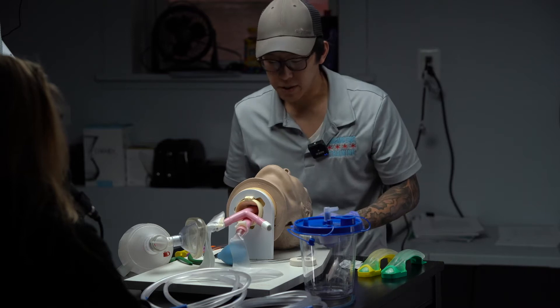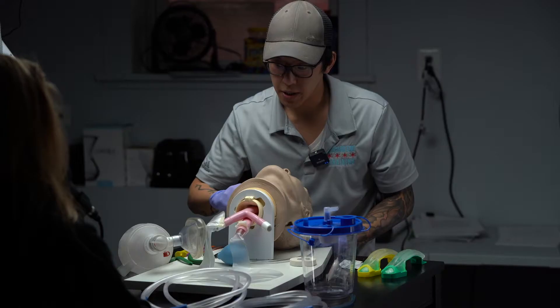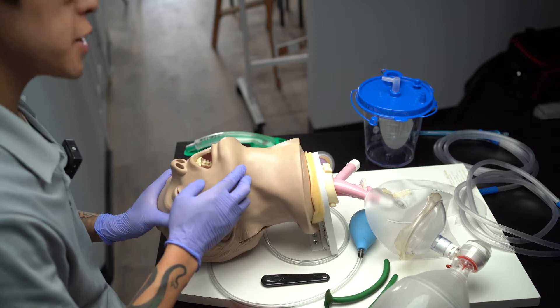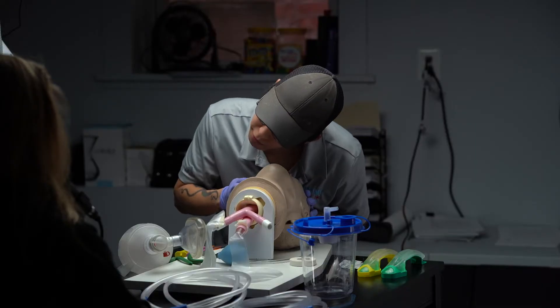I'm going to call for ALS at this time. I'm going to check for a pulse no longer than 10 seconds. You feel a weak pulse. No CPR is needed. I'm going to provide a head tilt, chin lift, and I'm going to feel with my cheek for a breath, and my eyes will be looking for the chest to rise and fall. Do I see any? No, the patient is not breathing.